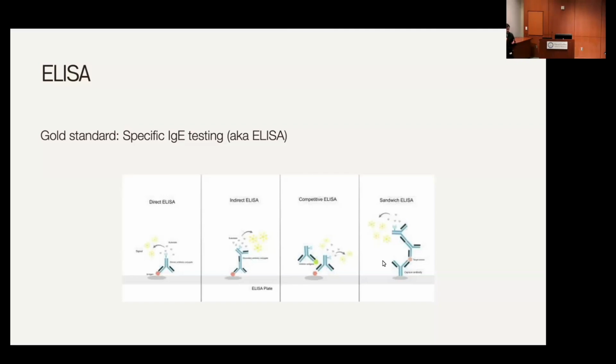So if we can isolate the antibodies that are responsible to fight this specific bacteria, then that means the patient is fighting a disease induced by that bacteria. So we'll go ahead and coat the bottom of the well with the bacteria, Borrelia burgdorferi. Then we'll introduce the patient serum onto the plate, and we'll give it some time to interface. And if the patient is in fact positive for Lyme disease, we expect the patient to have antibodies against the bacteria we just coated the well with.